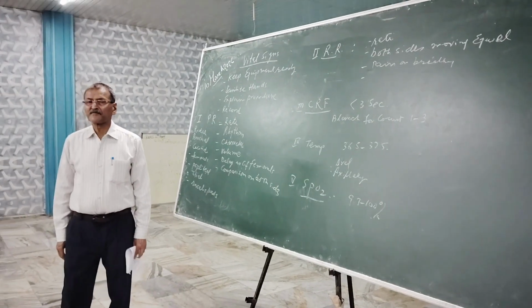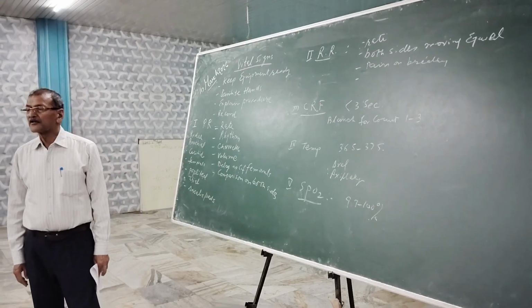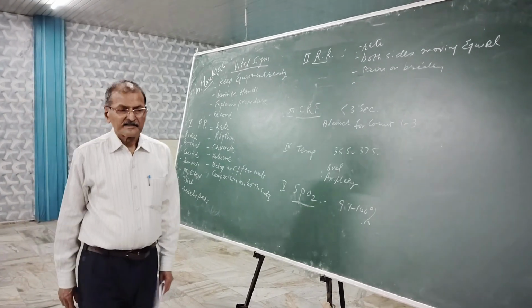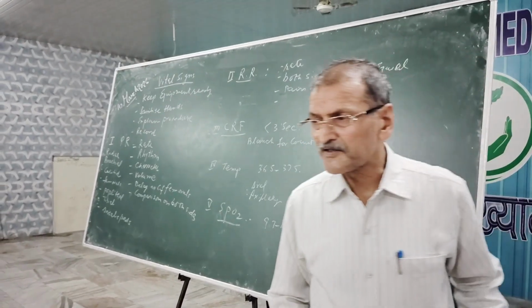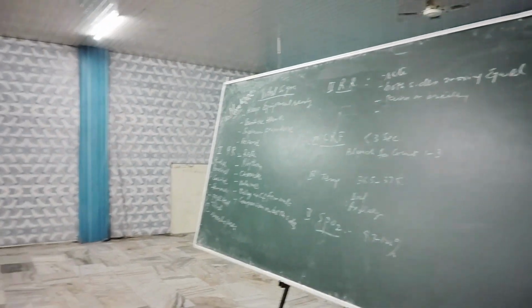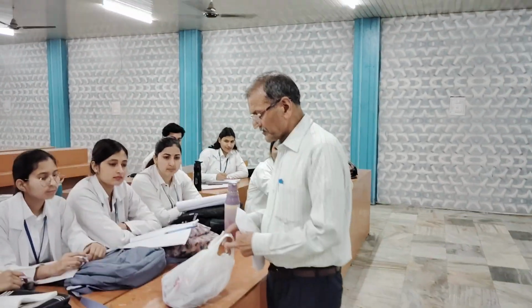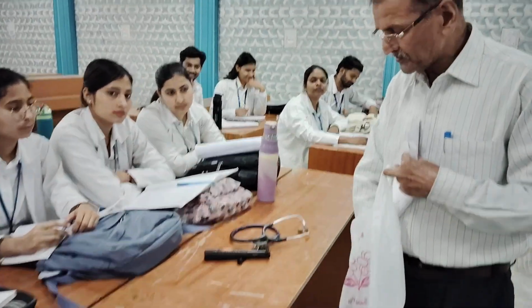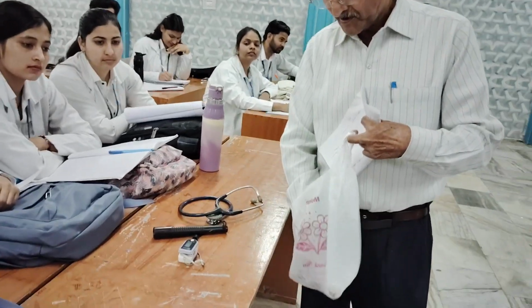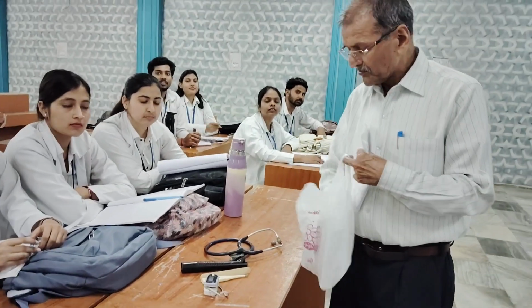Try to take the vital signs of the child. Always keep your equipment ready, and it should be placed well on the table, right? So that whenever you are taking, everything is available to you, right? So this is the torch, this is the pulse oximeter, thermometer, tongue depressor.